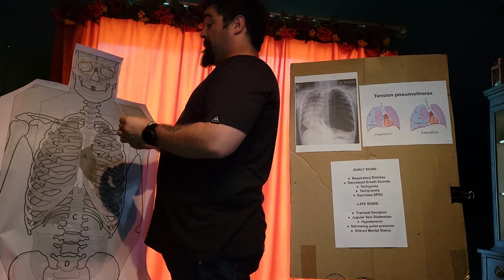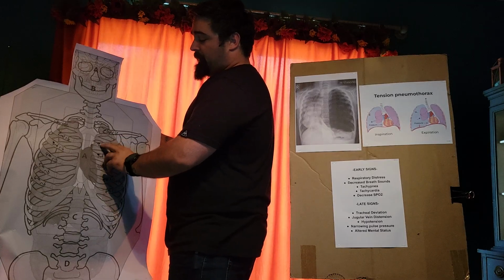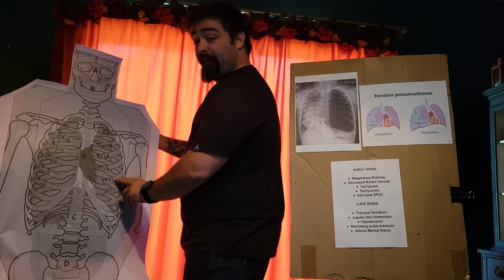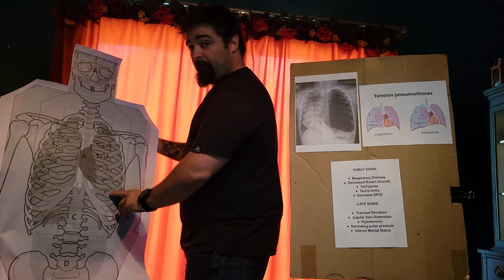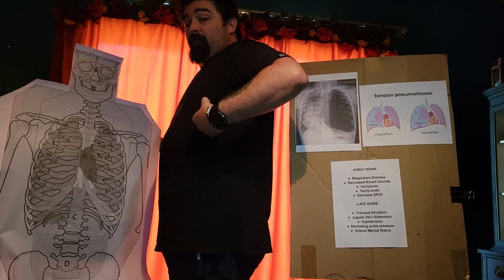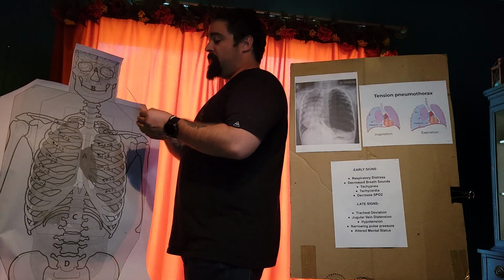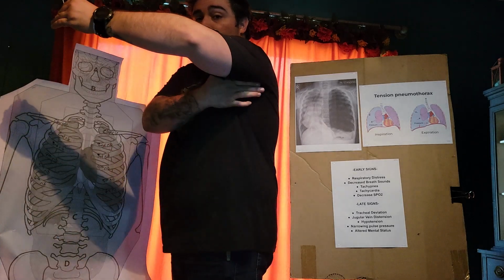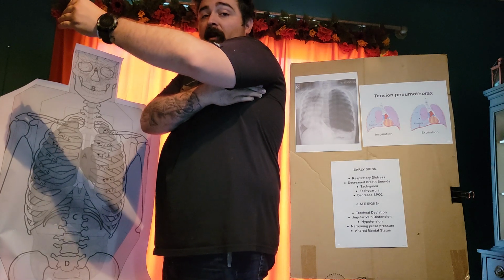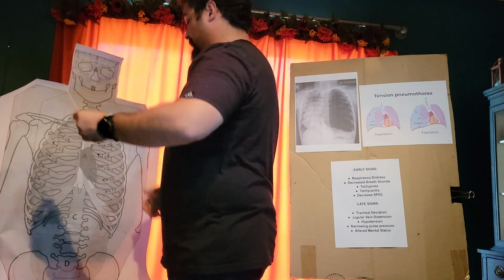You can palpate the same way you did. You can palpate on the chest down to the appropriate site. So your clavicle, 2nd, 3rd, 4th, 5th rib, 6th rib. You can palpate down the front, and then you can track that to the appropriate site, the anterior axillary. Another way to do it is to karate chop the patient's hand underneath their armpit, and then underneath that pinky finger will be a good estimate of where the appropriate site is.